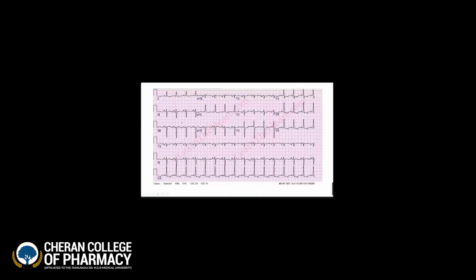So whenever we are checking for right atrial enlargement, there are two things to be checked more. We need to check for right ventricular hypertrophy as well as if the patient is suffering from pulmonary embolism. I'm not showing how to know right ventricular hypertrophy or pulmonary embolism, but always check for that. These 2 points need to be noted down. So with right atrial enlargement, the patient might be suffering from COPD. It is also known as cor pulmonale, P pulmonale.